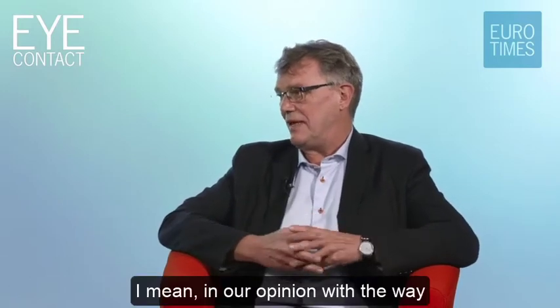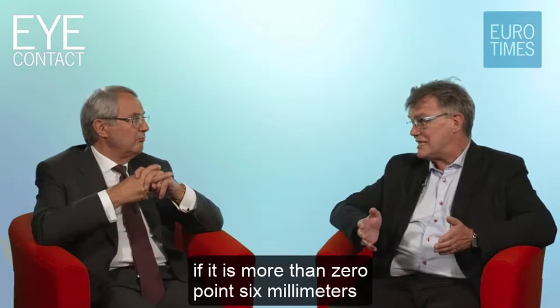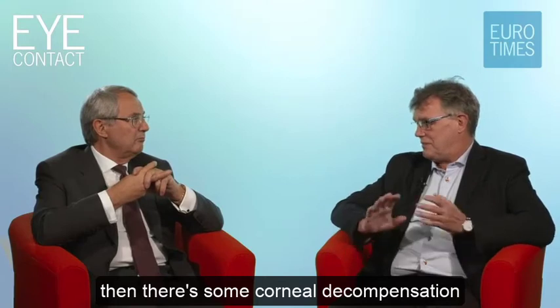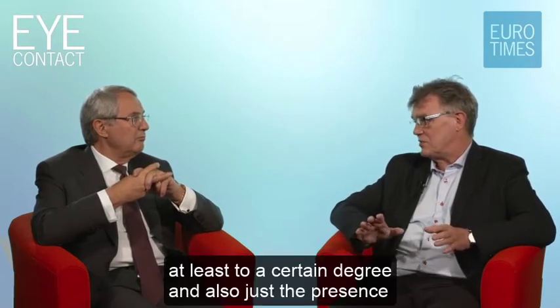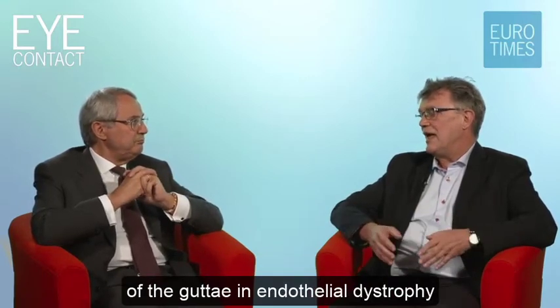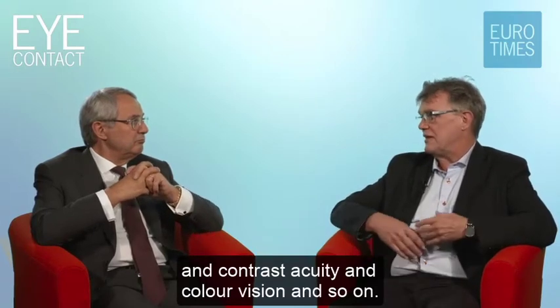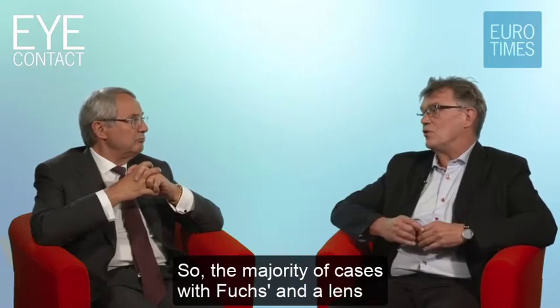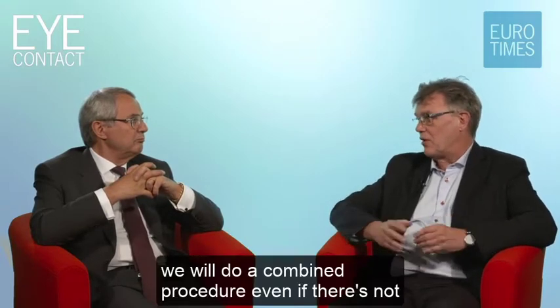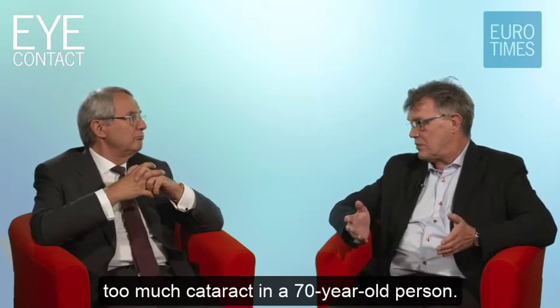I mean, in our opinion, with the way we measure corneal thickness, if it is more than 0.6 millimeters or something like that, then there's some corneal decompensation, at least to a certain degree, and also just the presence of the guttae in endothelial dystrophy can significantly disturb visual acuity and contrast acuity and color vision and so on. So the majority of cases with Fuchs and a lens, we will do a combined procedure, even if there's not too much cataract in a 70-year-old person.